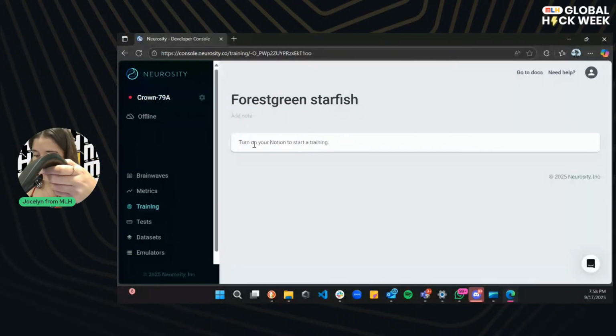So Bluetooth devices. Let me see. I think as I'm pairing it with a new device, maybe I need to put it in pairing mode.